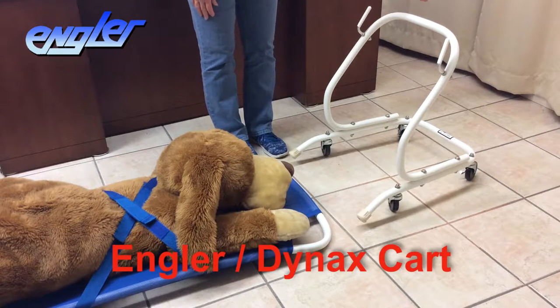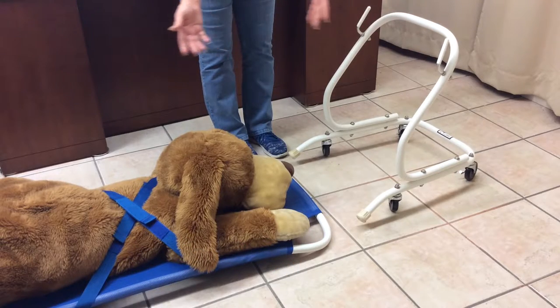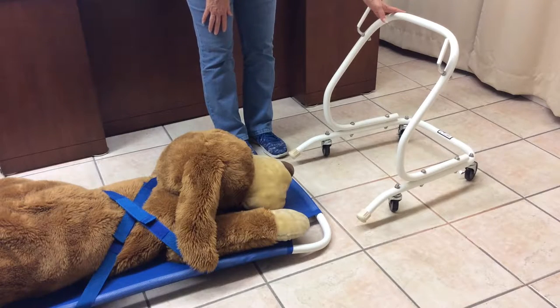The Dynax cart is extremely handy when everyone is busy and you're the only one available to move the patient from room to room. This is how you use it.